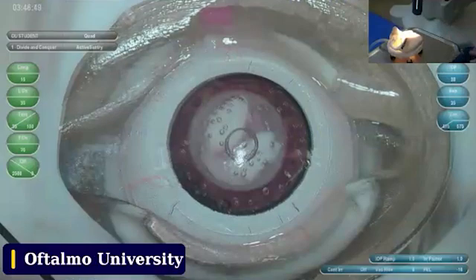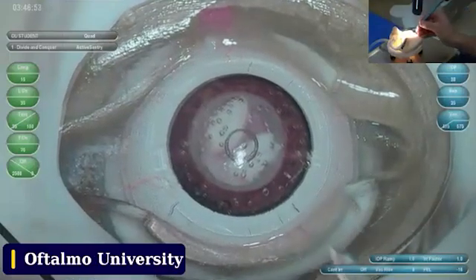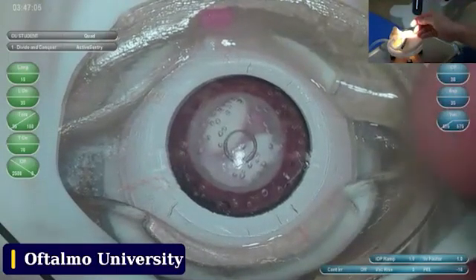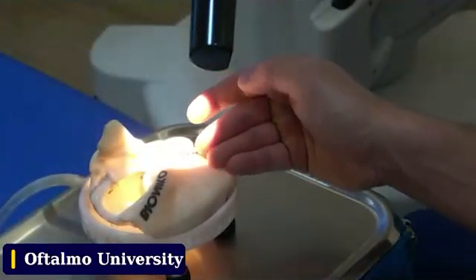There are two things that are extremely important: what happens outside the eye with your hands and your hand positioning, and what is happening in that incision. Let's put the hands big and talk about the hands.